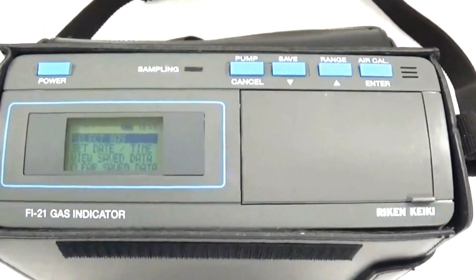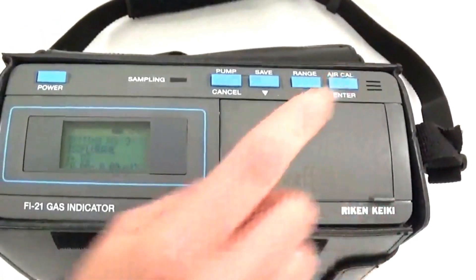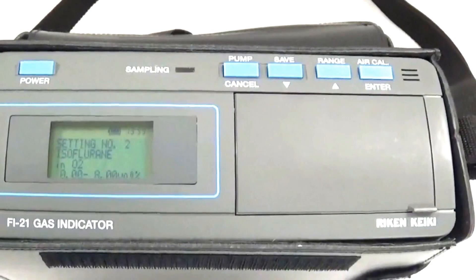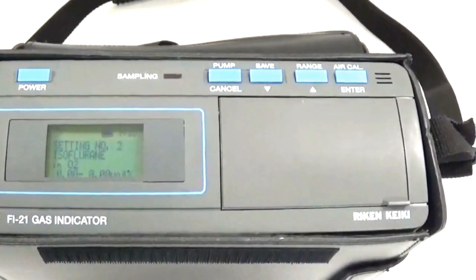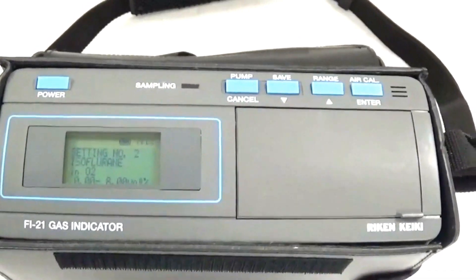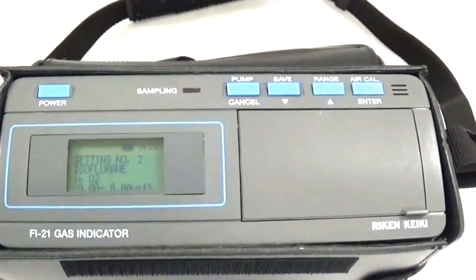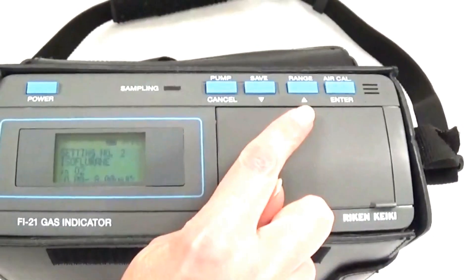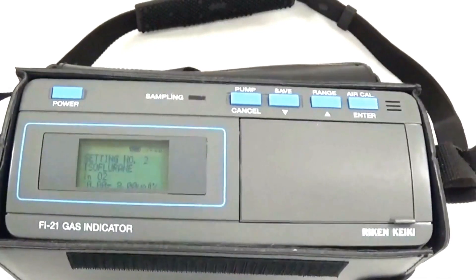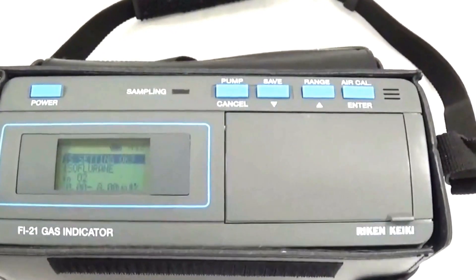Notice that Select Gas is now highlighted. Select Enter, and isoflurane and O2 appear — that is the anesthetic gas and carrier gas we will be using to verify this vaporizer. If you would like to select another anesthetic agent or carrier gas, you can arrow up or down to get to the gas you will be verifying. Select Enter again, confirm the setting is OK, and select Enter again.